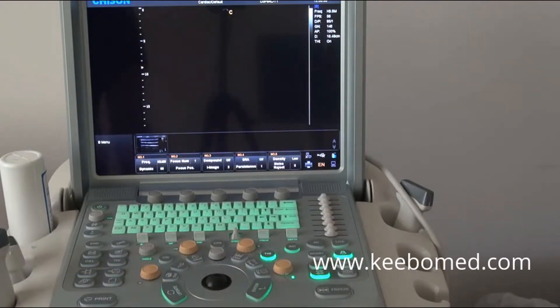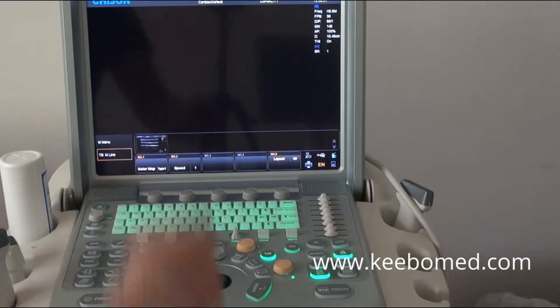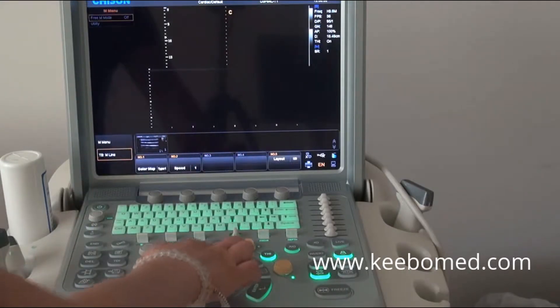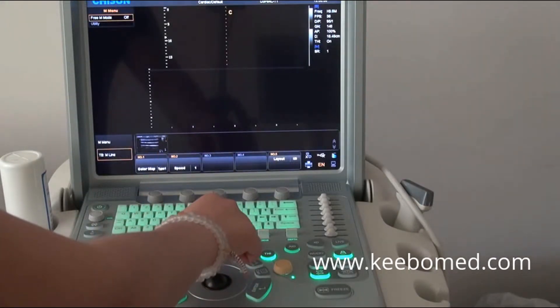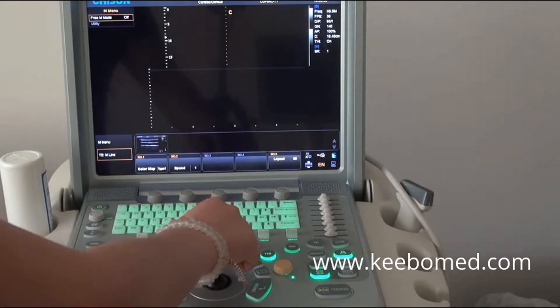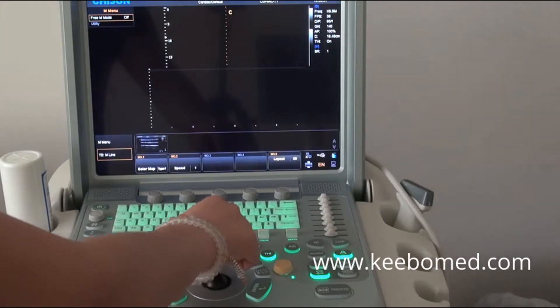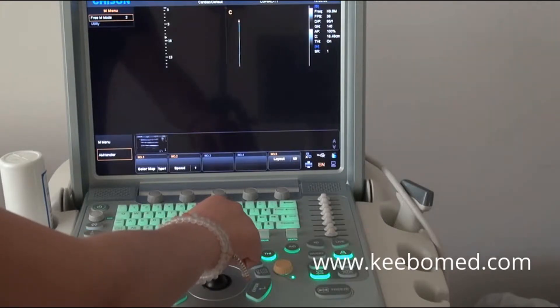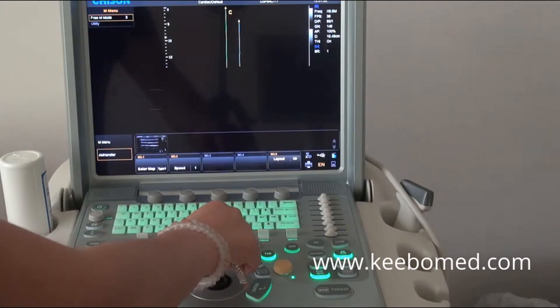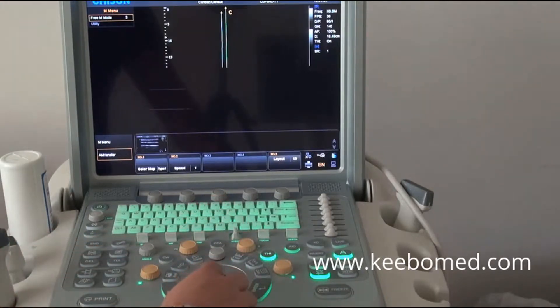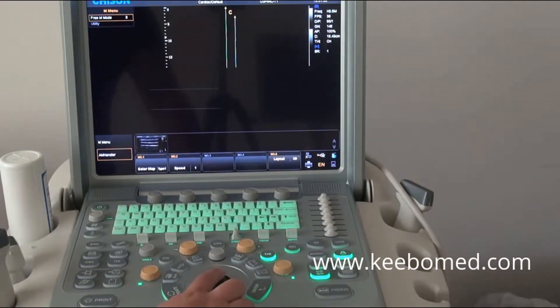After that, go back to B mode. Press the M key to go into the B mode. Press the menu key to open the free-steering M mode. You will find one sample line, two sample lines, and three sample lines. Each sample line can be rotated 360 degrees.